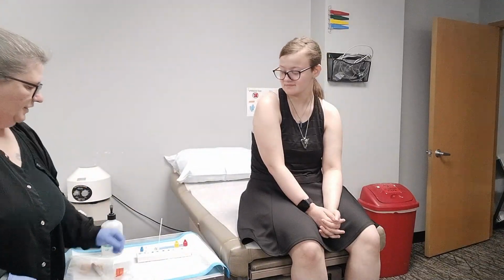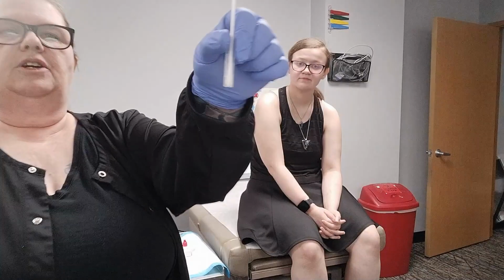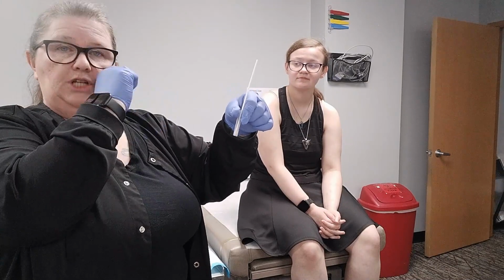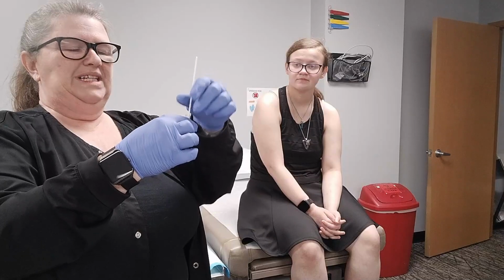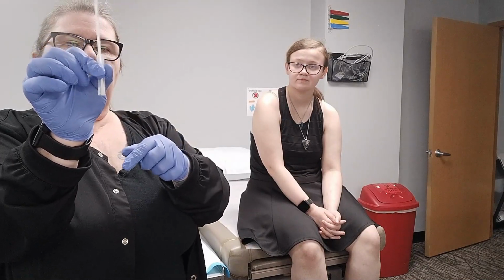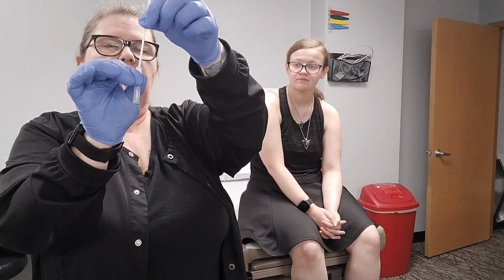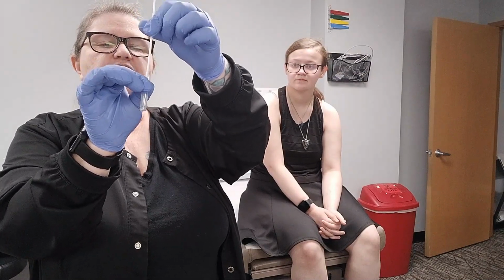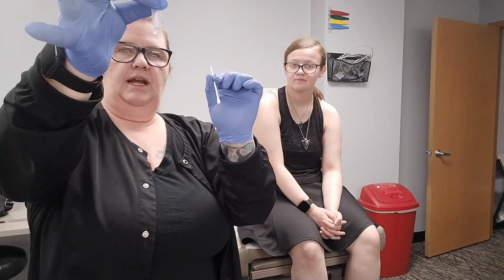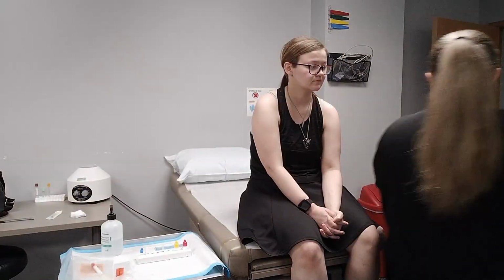Okay, it's been about a minute, I think. So now what we're going to do is, if you see there's liquid in there, also is the specimen that came off of her tonsils. So we want to make sure plenty of that stays suspended in that liquid. This is a plastic tube that we can squish a little bit. So as I'm bringing this out, I'm just going to squeeze and twist a little bit and squeeze to get as much of that liquid and specimen off of that cotton as humanly possible. And that's what I'm left with. I'm going to put this back in here. The swab will go into biohazard.